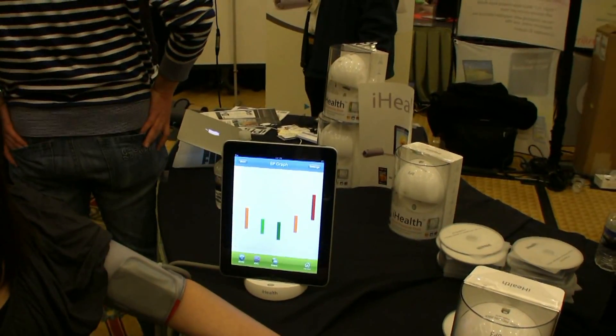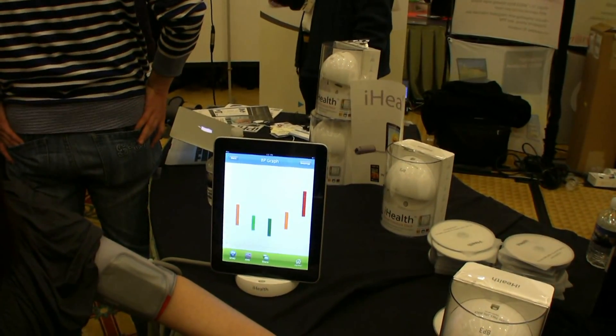The iHealth is $99, and it's available on the iHealth website, iHealth99.com. Looks like a great program, and again, this is Kelly from LockerGnome.com.